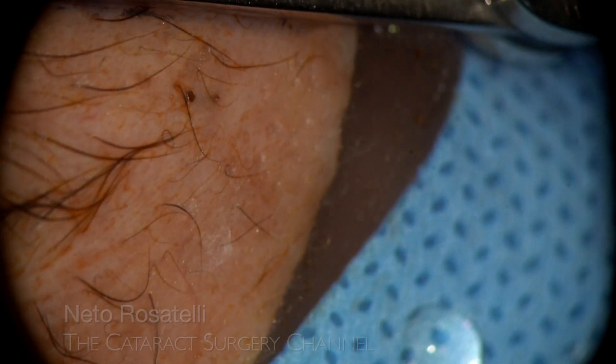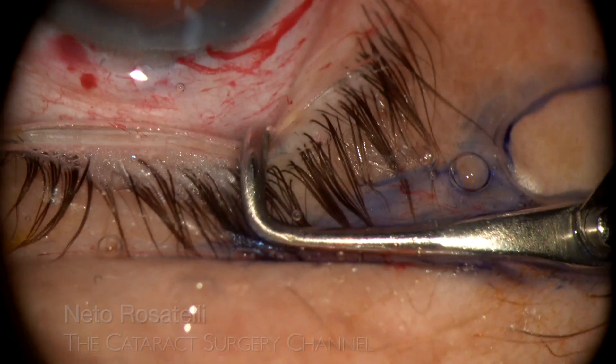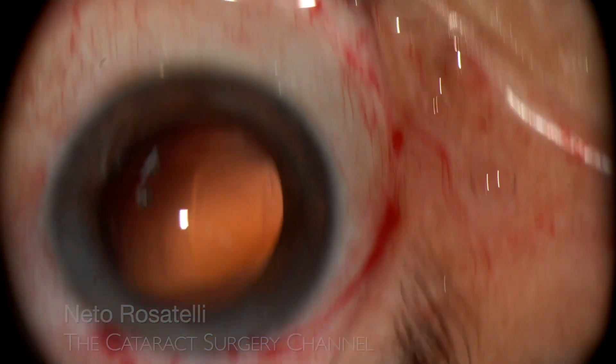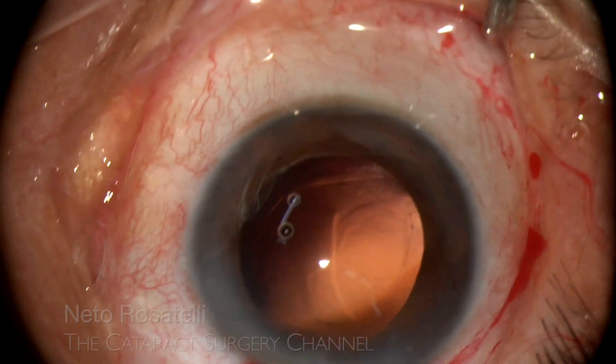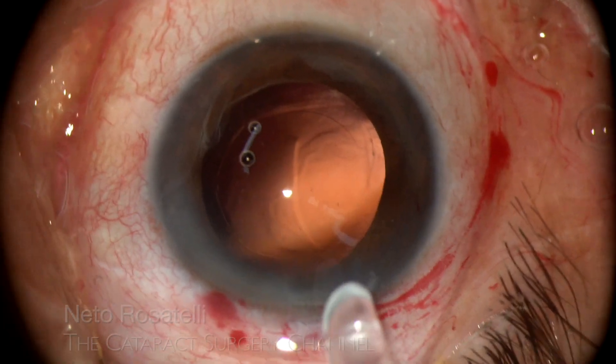Guess what's happening now? The patient is having a coughing fit — yes, with the posterior capsule wide open and the anterior hyaloid right there. I gather all the courage I can, center the eye back to take a look, and it is unbelievable: things are as if nothing happened. Cataract surgery is not for wimps.